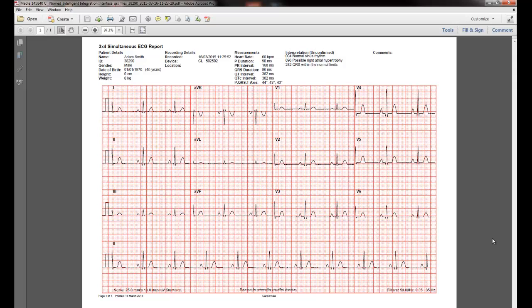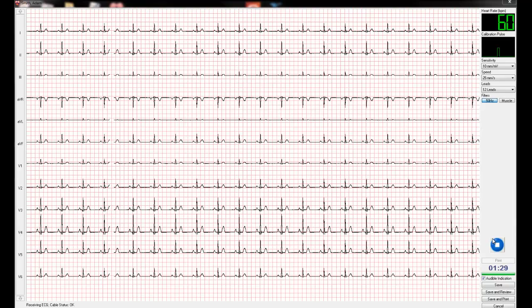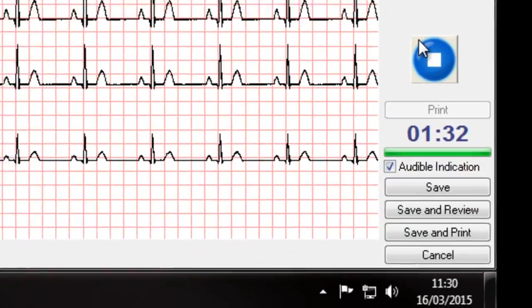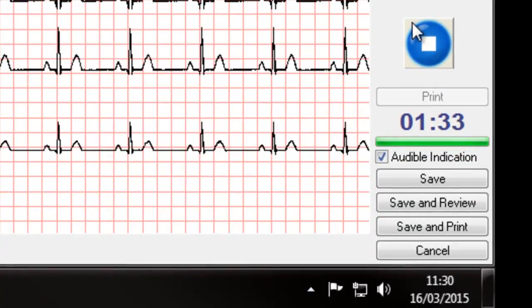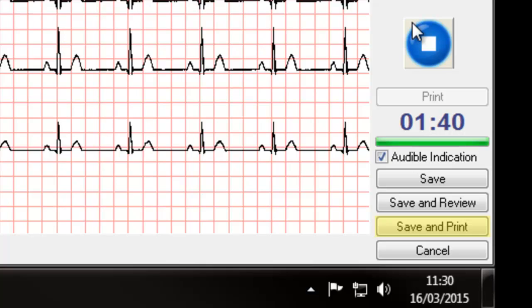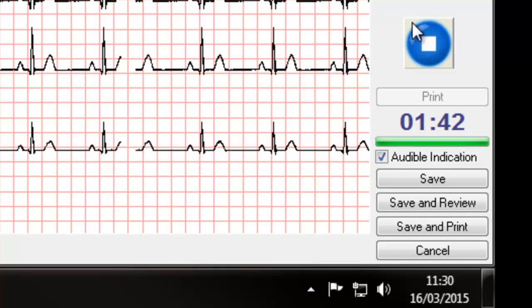This concludes the basic ECG capture and filing process. We are now going to show you some additional options available when capturing an ECG, the first of which is Save and Print. If this option is selected, the ECG will be captured and you will be taken into the filing process, just the same as clicking the Save button. However, the software will also send a request to the default printer for a hard copy of the ECG report.